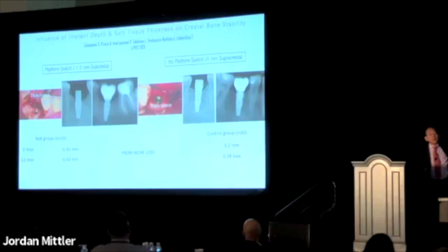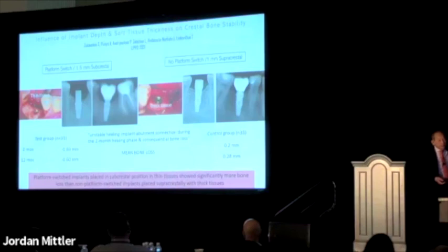But what's interesting is that he couldn't really explain why other studies found different results. Other folks didn't find this result. So what did he conclude? He concluded that it is the connection of the implant that was used in this study, an unstable healing implant abutment connection during the 2 months of healing. Now remember, this was only based on 2 months follow-up. There was no loading. It was just the abutment. That it's the unstable connection that resulted in this bone loss.